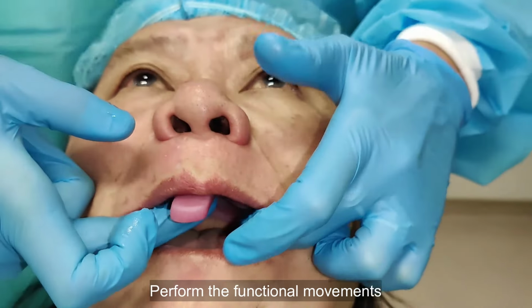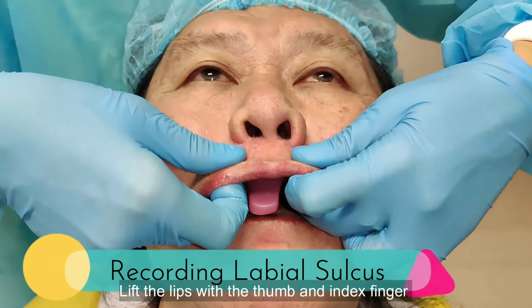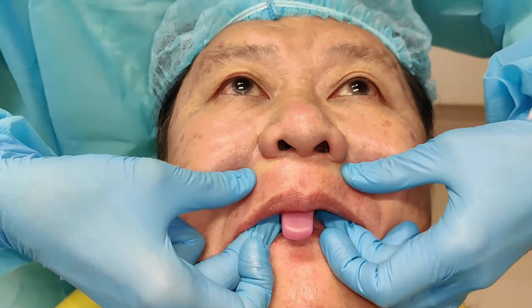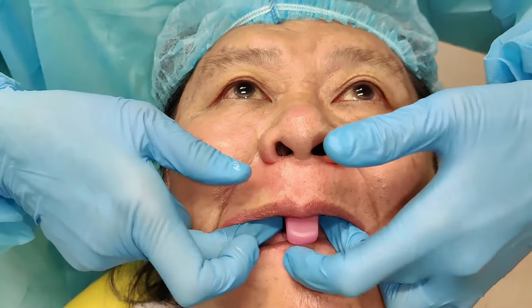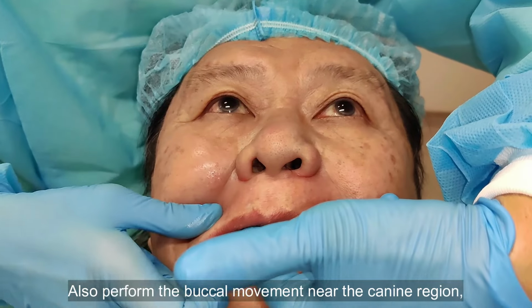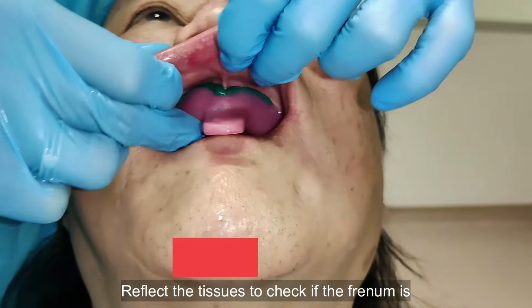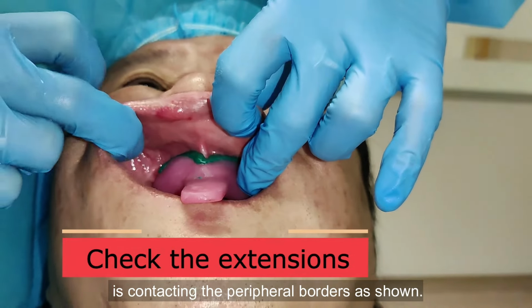Perform the functional movements for recording the labial sulcus. Lift the lip with the thumb and index finger outward, downward and inward. Also perform the buccal movement near the canine region in order to avoid any overextension. Reflect the tissues to check if the frenum is recorded well, and also whether the material is contacting the peripheral borders as shown.